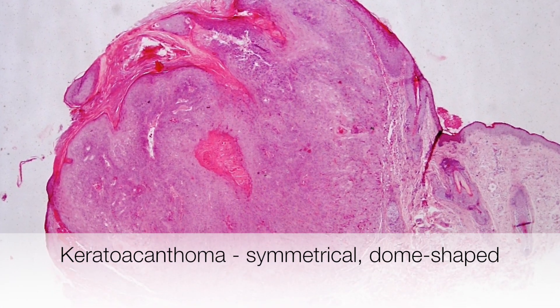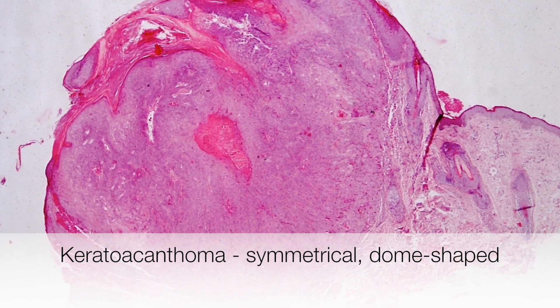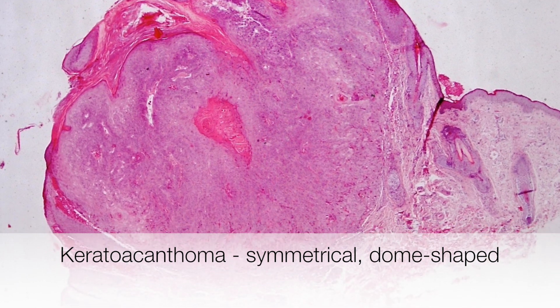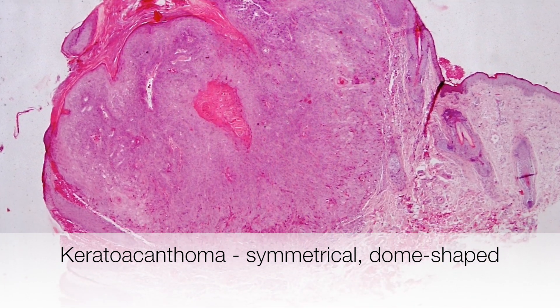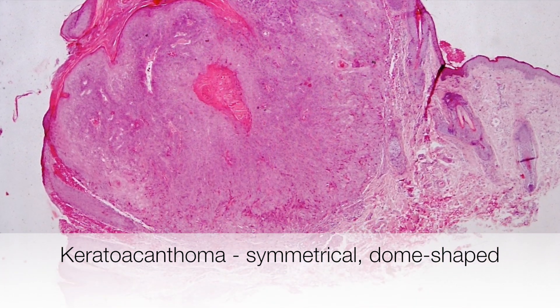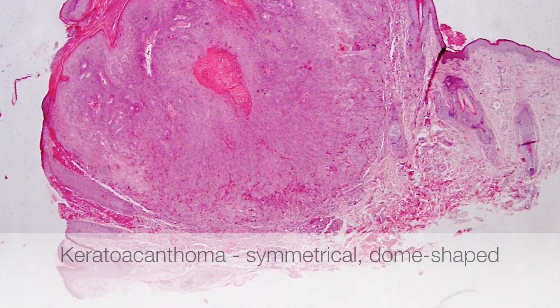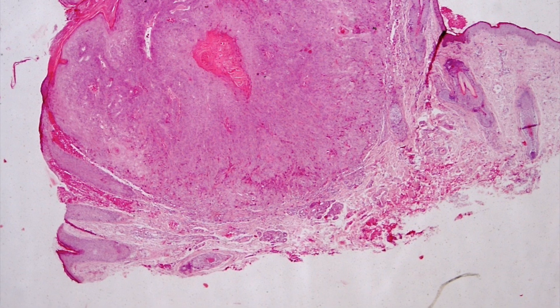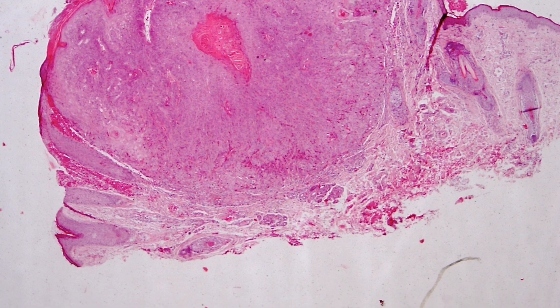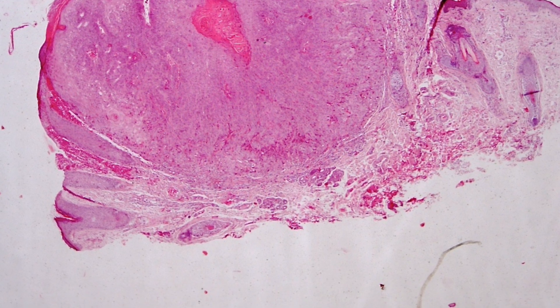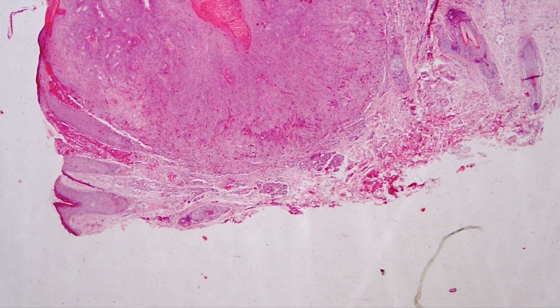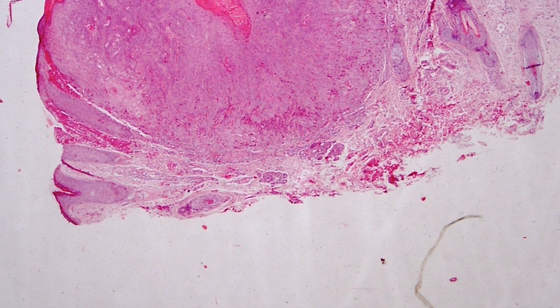This is a low-power view of a typical keratoacanthoma. It is symmetrical and dome-shaped, and has both exophytic and endophytic growth patterns.